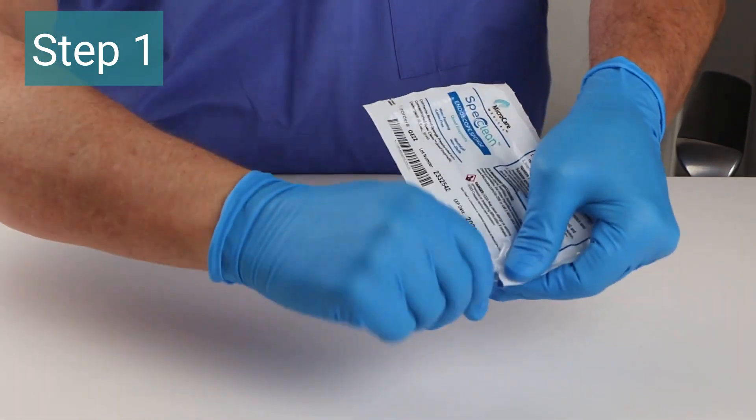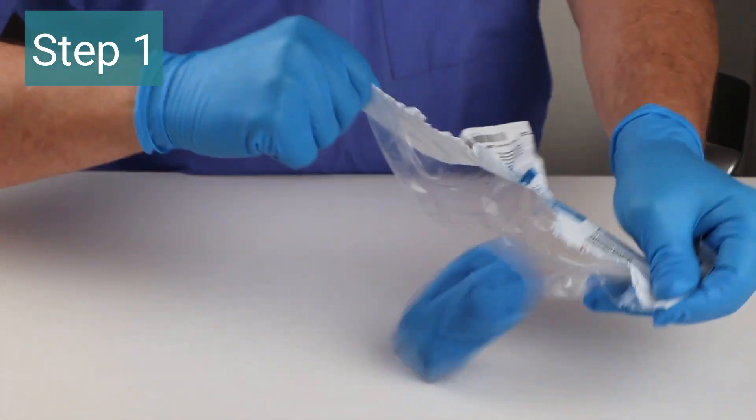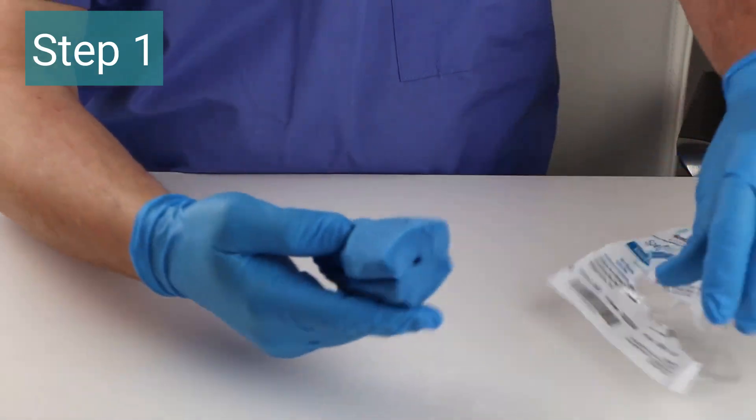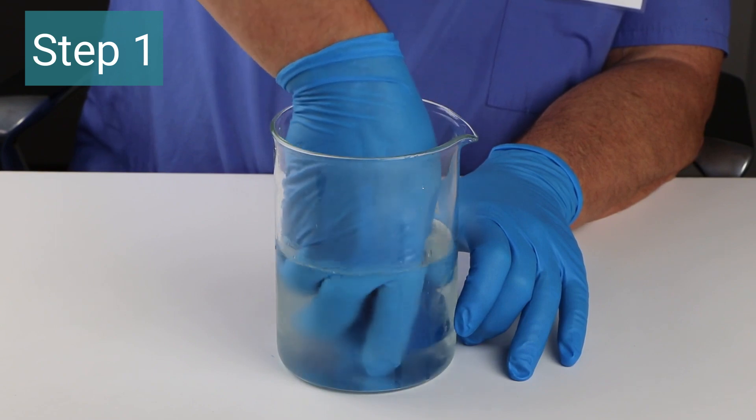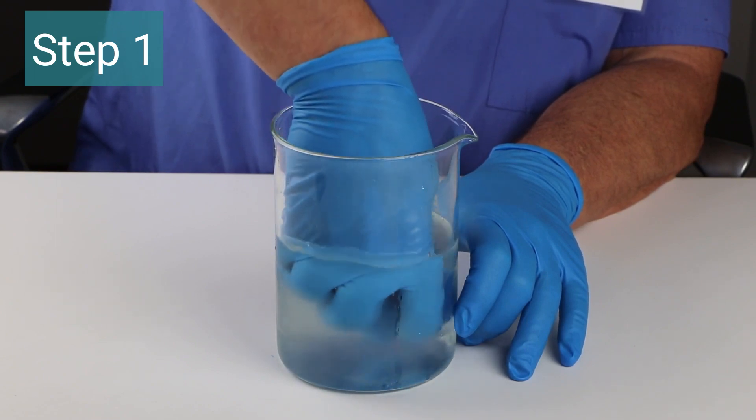Step one: open the SPEC Clean Endoscope Sponge packaging and remove the pre-saturated sponge. Place it in water and squeeze three to five times to activate the multi-enzymatic detergent.